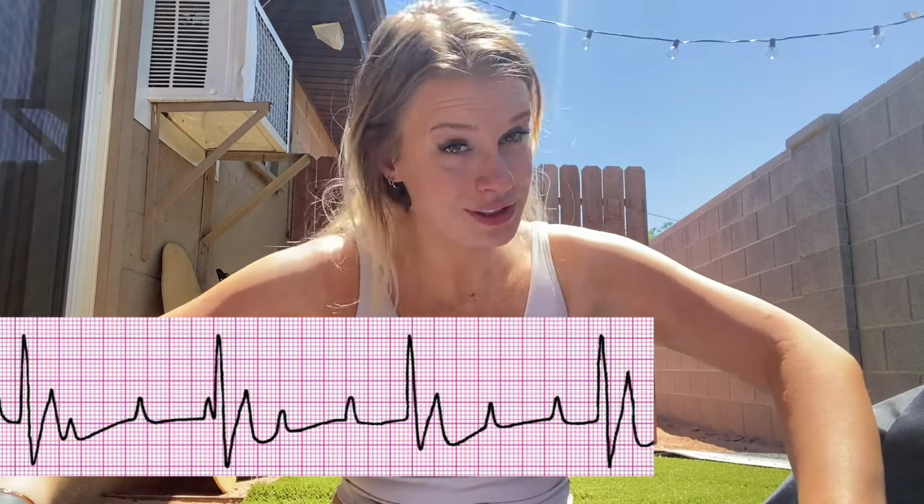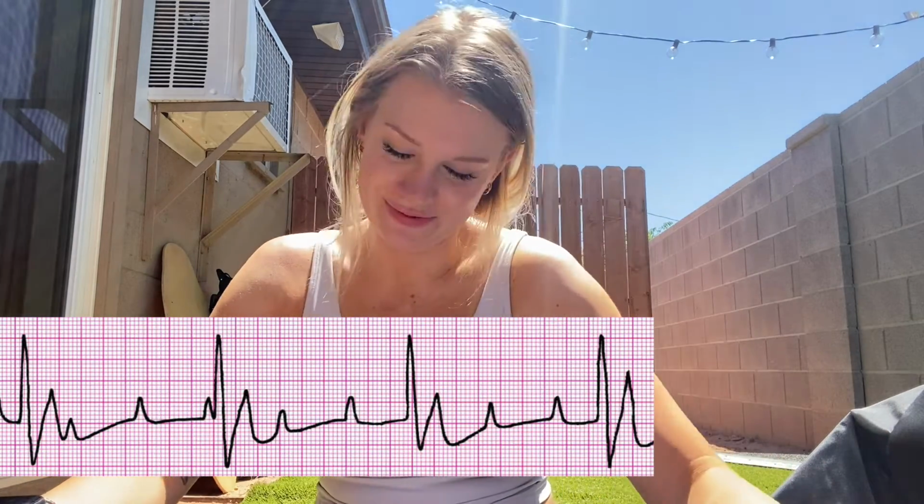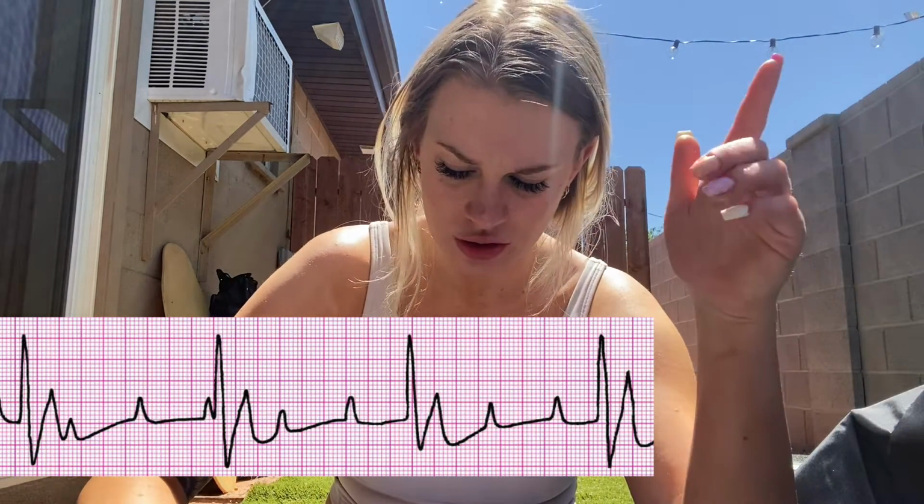So the physical manifestations of this one are the usual suspects, and then fainting, fatigue, and dizziness. The atria will probably have a range from 60 to 100 beats per minute, and the ventricles will have about 40 beats per minute. The QRSs will probably be at 40, and the junctionals are going to be at 40 to 60.